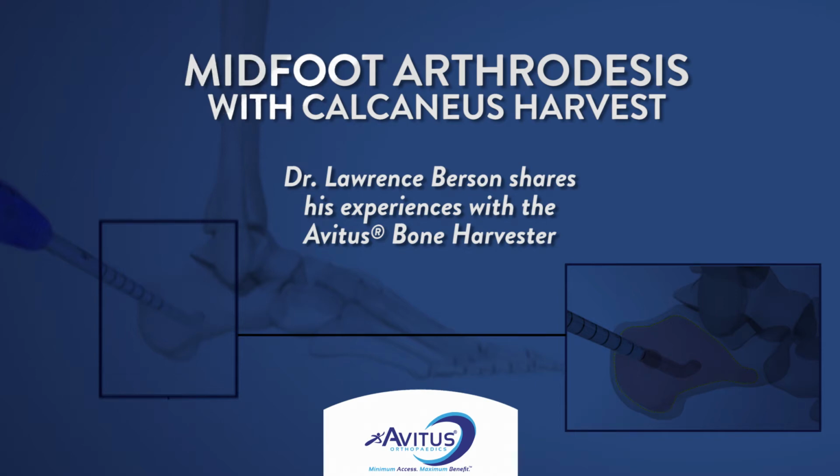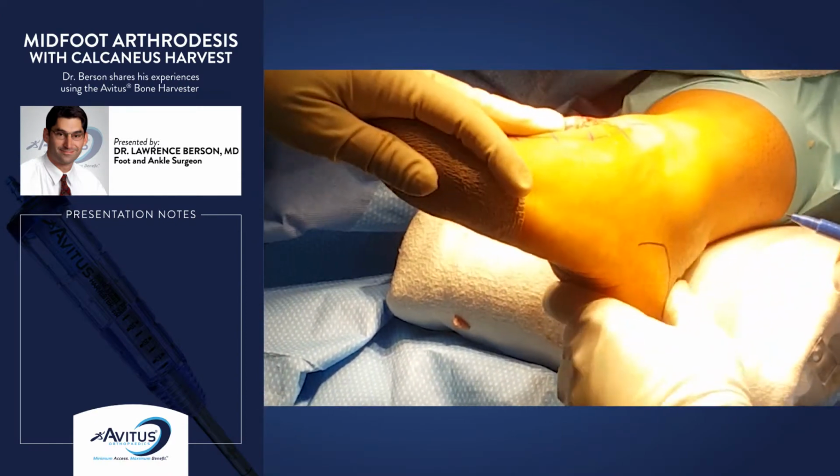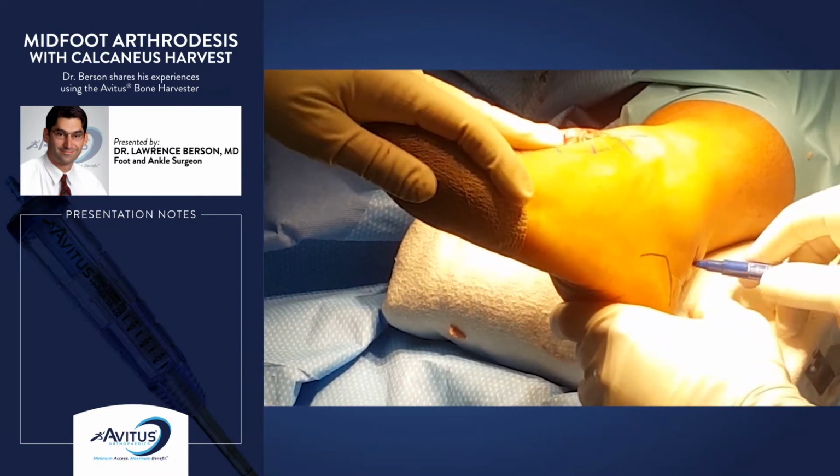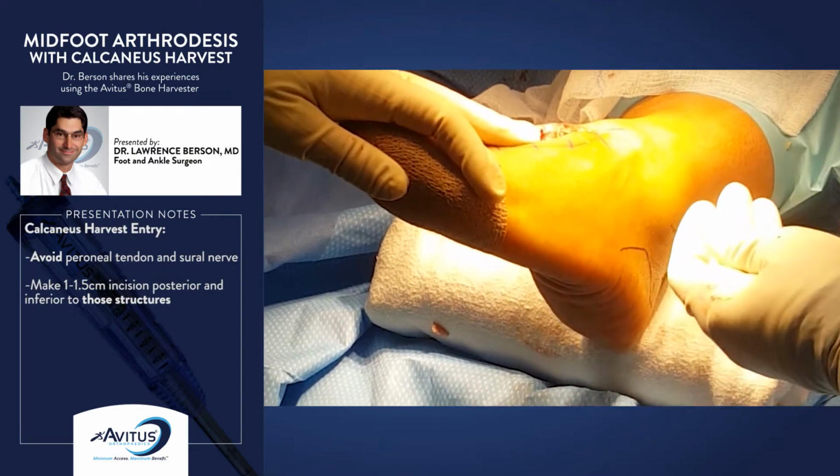This was a revision midfoot arthrodesis, first and second TMT joints, that had a fair amount of bony surfaces that we needed to pack the bone graft into. All right, so I'm marking out the anatomy of the calcaneus.